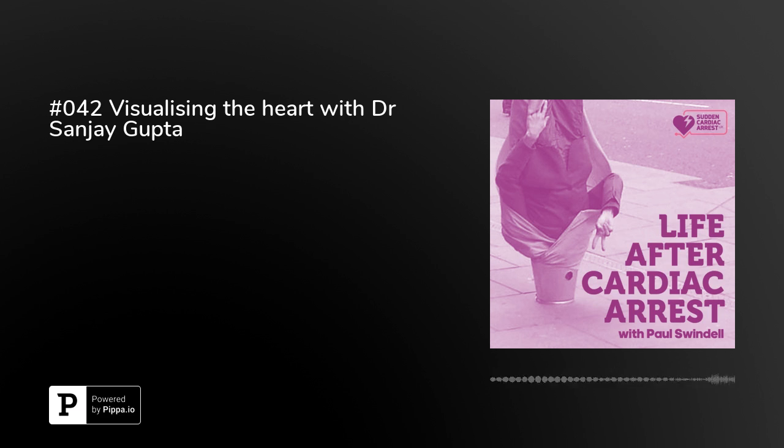So if you wanted to visualize the heart arteries, then the next step would be to do something called cardiac CT scanning, which has now become the gold standard for looking at heart arteries, for the majority of patients with chest discomfort. And with cardiac CT, what you're doing is you're delineating the heart arteries themselves. And that will then tell you whether the heart arteries are narrowed or whether there are any blockages, etc.